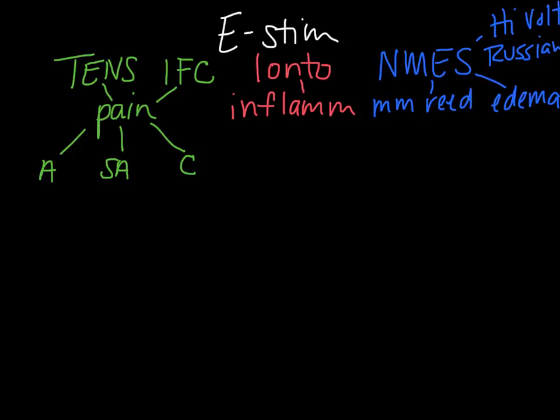And if our patient is more in an acute phase of healing, we're going to want to go towards settings that are considered kind of conventional TENS. So I'm going to just abbreviate that with CONV, but that's a conventional sensory level TENS. The purpose of conventional sensory level TENS is to stimulate those larger sensory fibers, providing pain control via the gate control theory of pain relief.